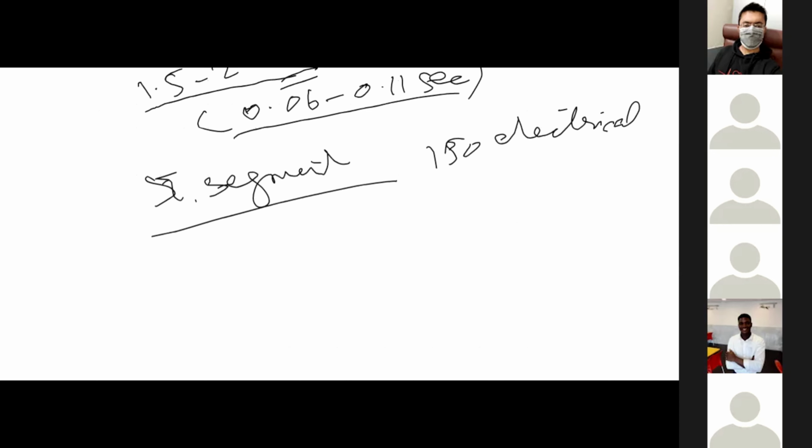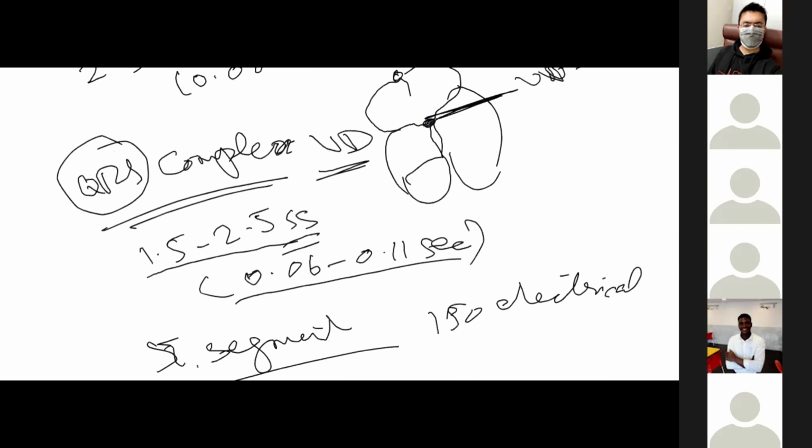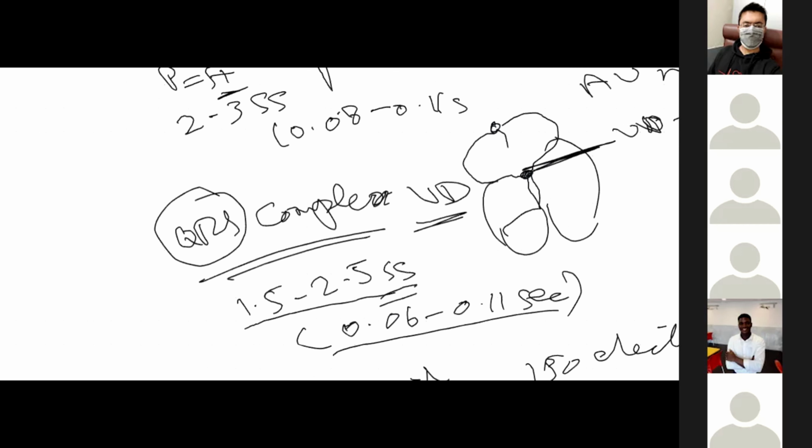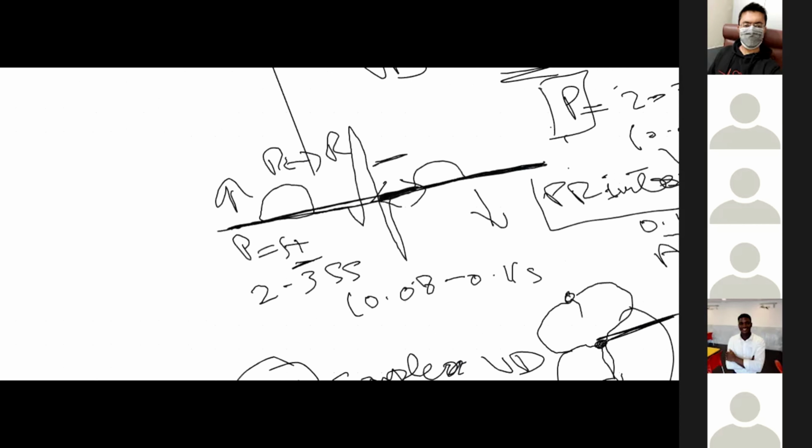And then there is a T wave. Yes, there comes a T wave. So our main focus right now will be these normal values.